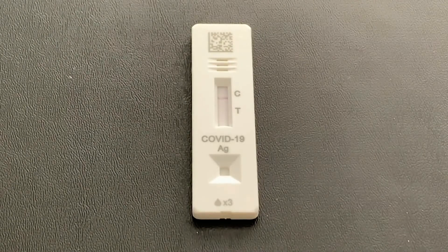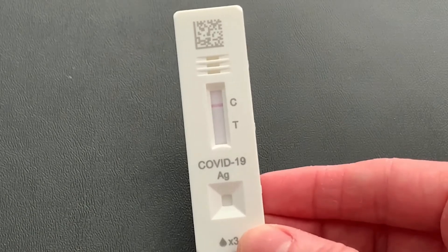As you can see here, the control section is working, and thankfully that test section is clear. I think everyone should have one of these kits at home just to make sure you always have access to a test whenever you need it. I highly recommend these for anyone who needs quick test results at home.